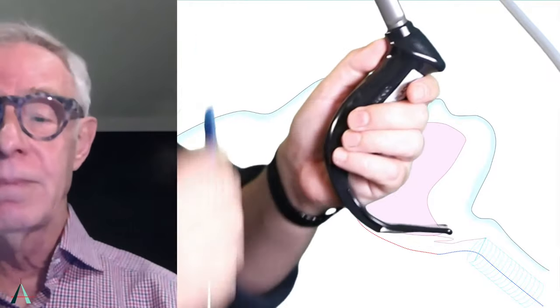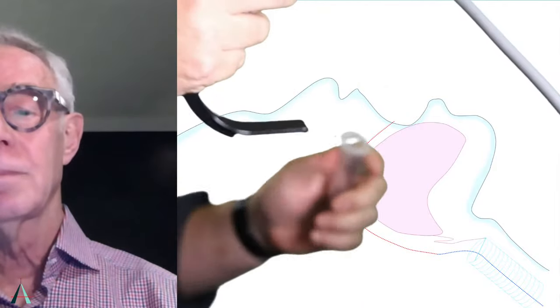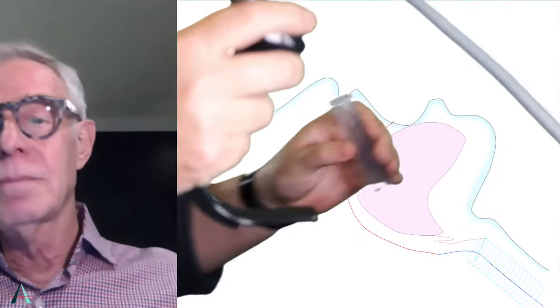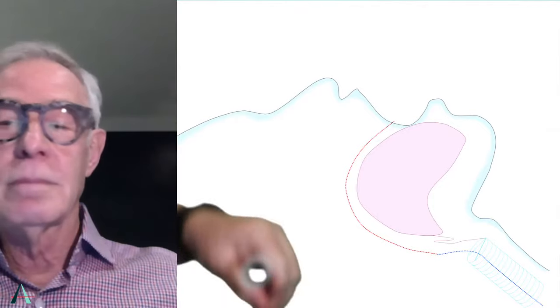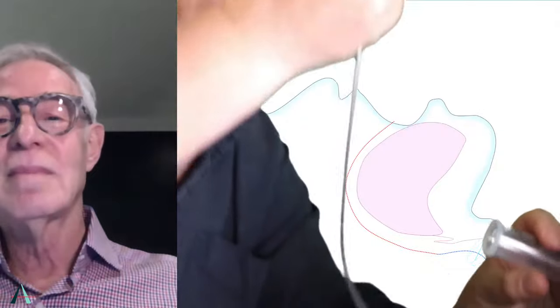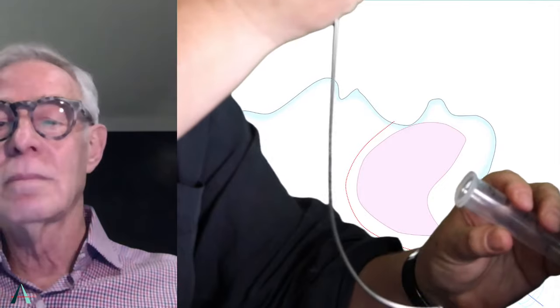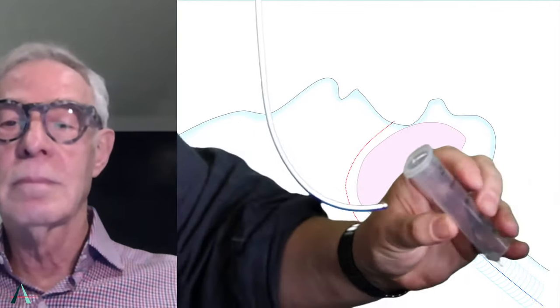No, go ahead. I was just going to say, just to expand on my interpretation of what's going on, that maneuver you talked about, which we'll show in a moment, where you're lifting up, this is the thing I've been calling on Twitter the Cooper maneuver, pulling up along the axis of the stylet. And that's quite an unusual maneuver. We don't usually do that.